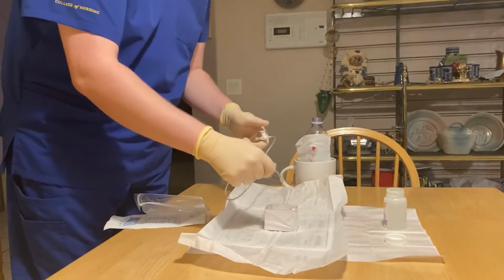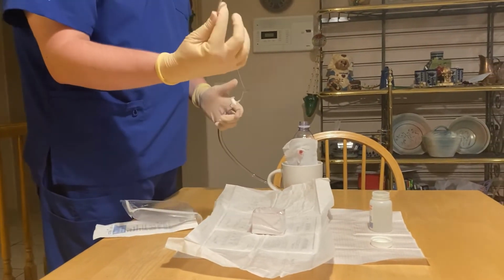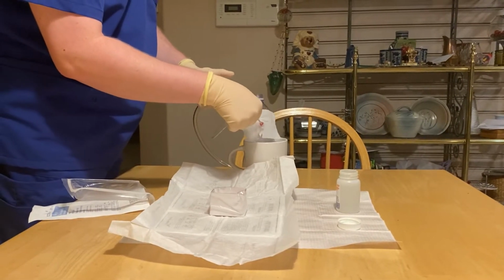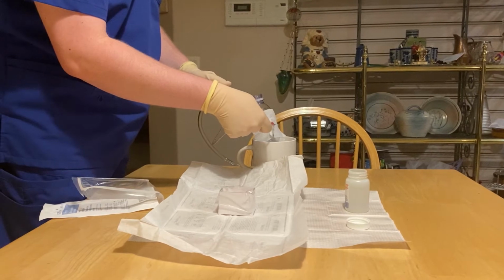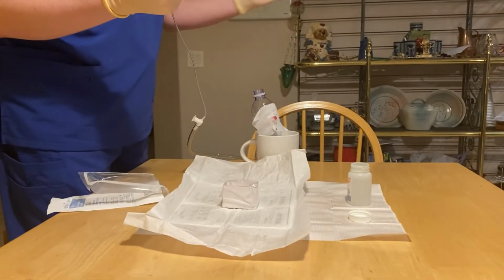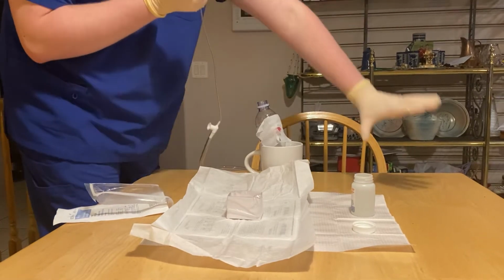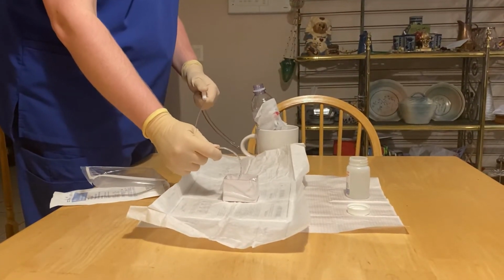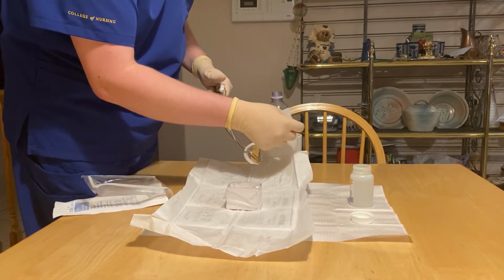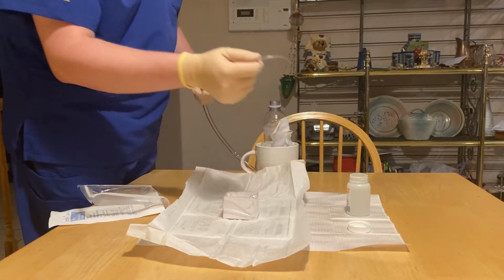So I would test the suction. Test with water, it works. My next thing I would go ahead and do is insert with thumb off until I met resistance, making sure not to touch anything else, and then start suction. Take out, let go, grab the ambu bag, give him a couple breaths, 1, 2. Put the ambu bag back down, come back, clean the tube, and then if he needed another one, I would go back in. And then suction, 1, 2, 3, and then come back out.